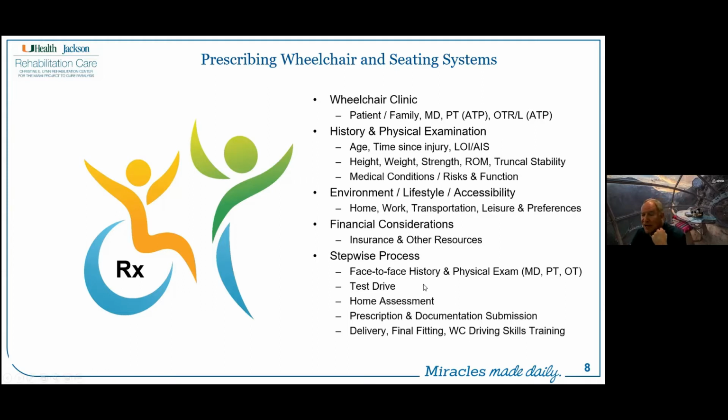Doing a test drive, ideally in a system that they have not had to purchase yet, as well as a home assessment, and then putting together the prescription and documentation for the insurance company. My hope is that we do this all right the first time and there's not a delay.